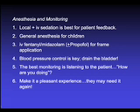Of course, for children, general anesthesia is used. We find that IV fentanyl and midazolam, with or without propofol for frame application, is well tolerated. Blood pressure control is very important for stereotactic surgery, and a full bladder, sometimes associated with contrast infusion, can be associated with hypertension. It's best to have the bladder drained and the patient already voided. The best monitoring, I believe, is listening to the patient and asking them how they are doing. It's important to make this as comfortable an experience as possible.